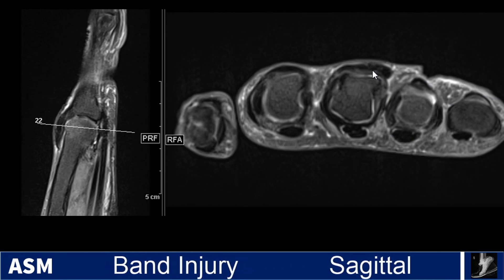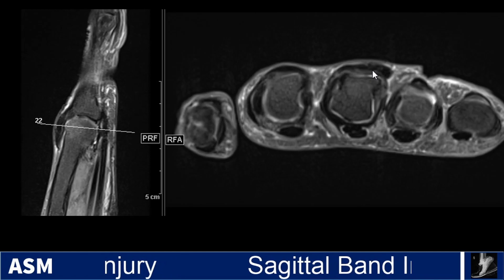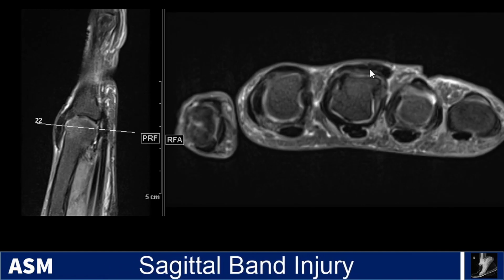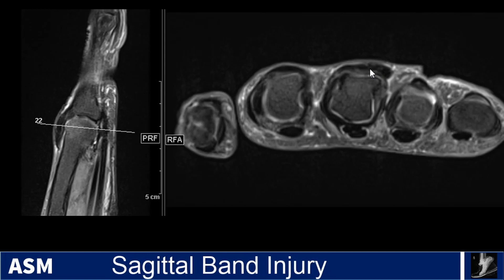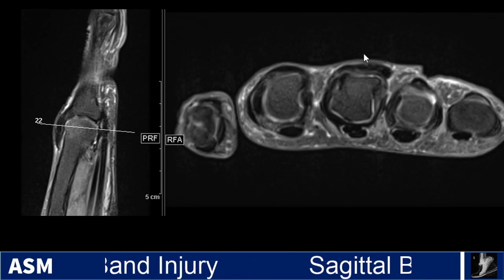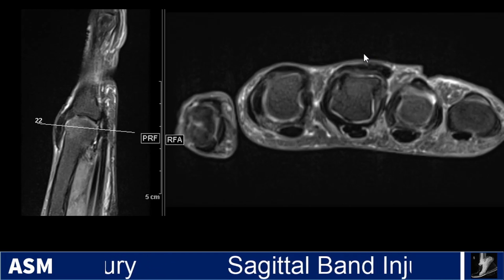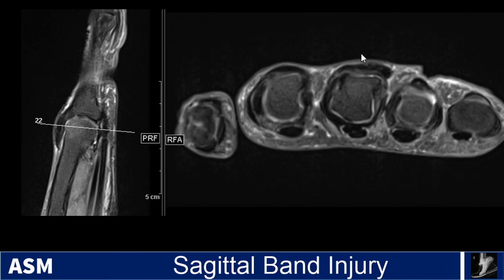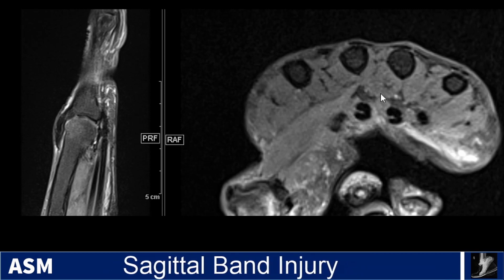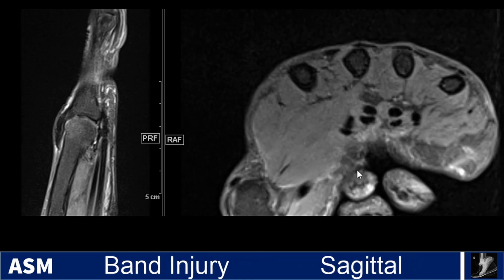One way we can really accentuate the instability is by having the patient flex their digits. Sometimes this is apparent on dynamic ultrasound or even clinical exam, and if you're able to do it for MRI, it is also usually going to be apparent. Here we see an axial proton density fat suppressed image with the patient in flexion.